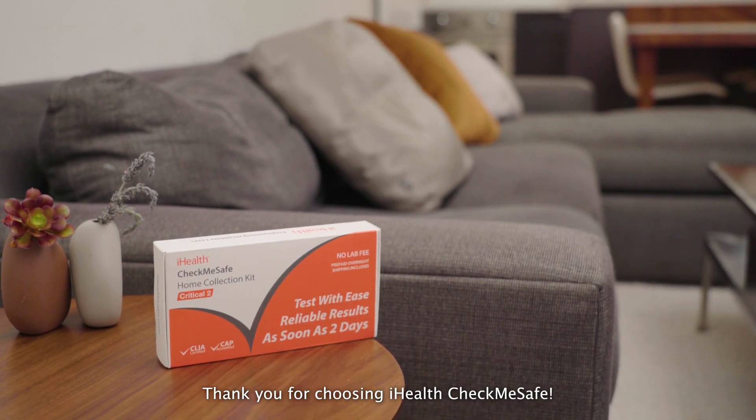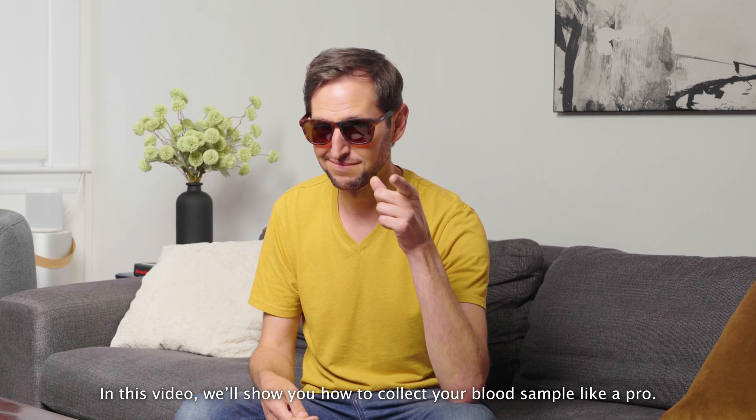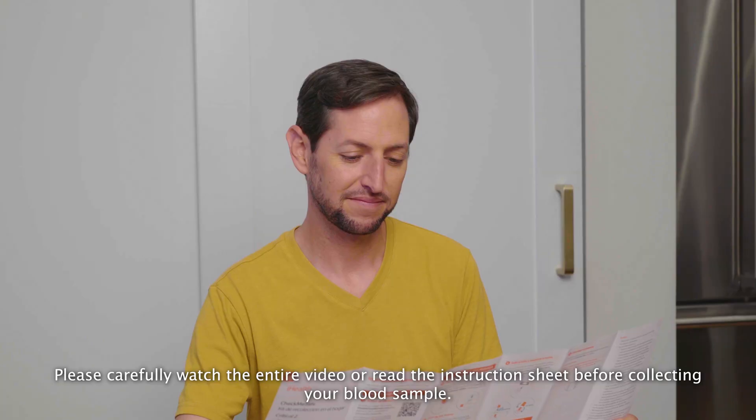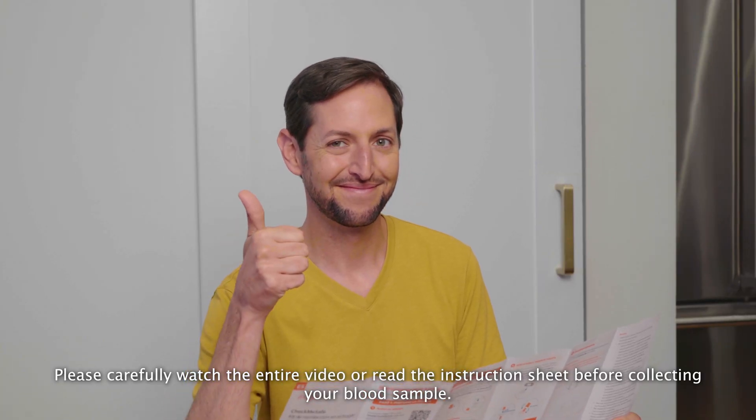Thank you for choosing iHealth Check Me Safe. In this video, we'll show you how to collect your blood sample like a pro. To make the sample collection process as smooth as possible, please carefully watch the entire video or read the instruction sheet before collecting your blood sample.